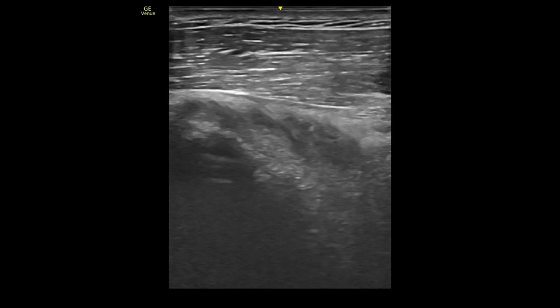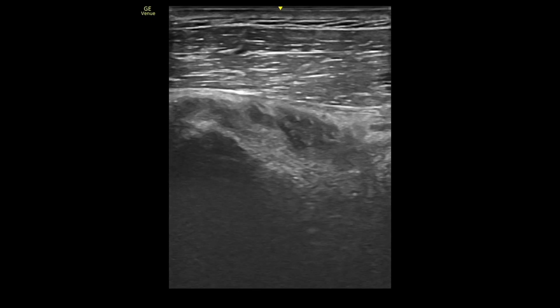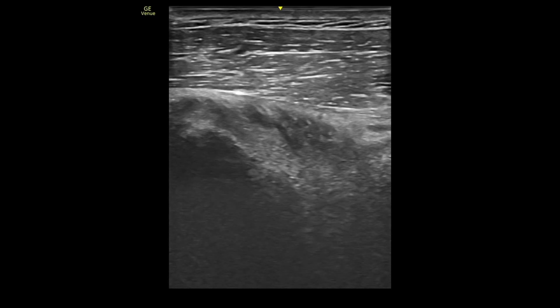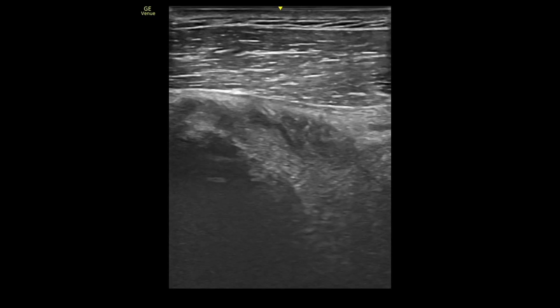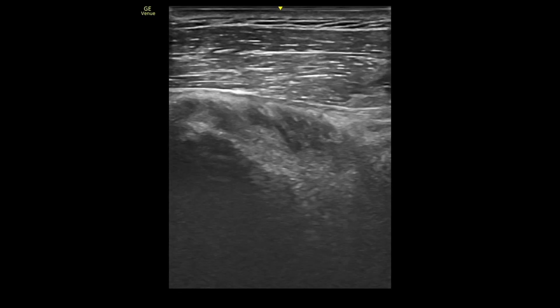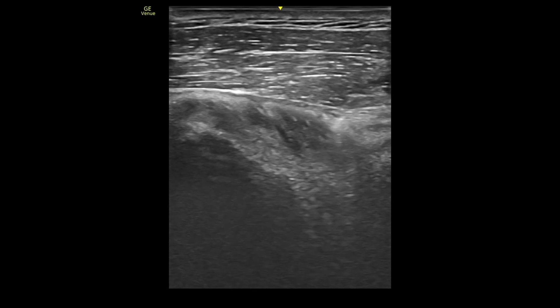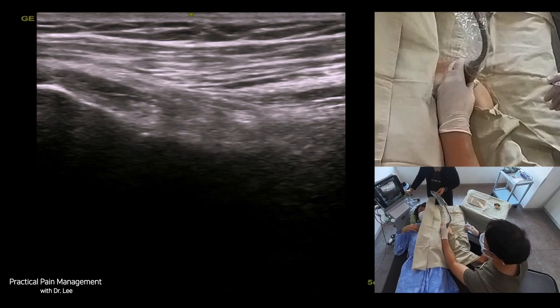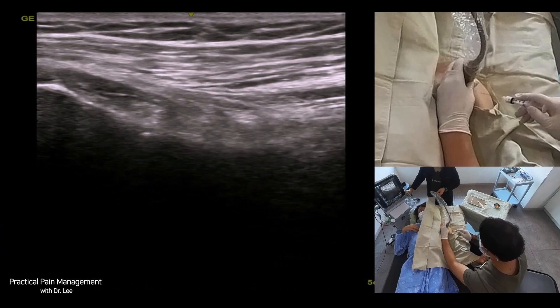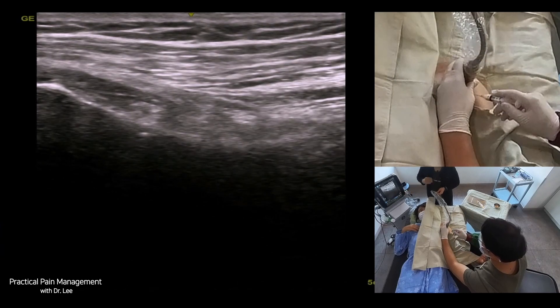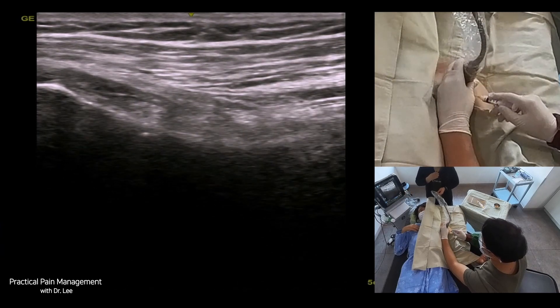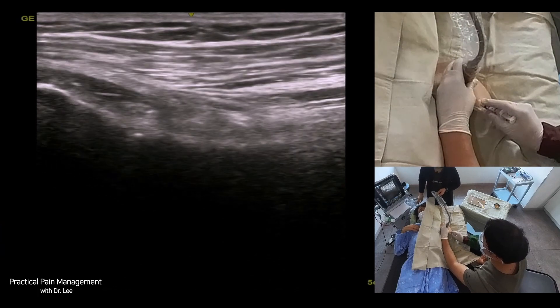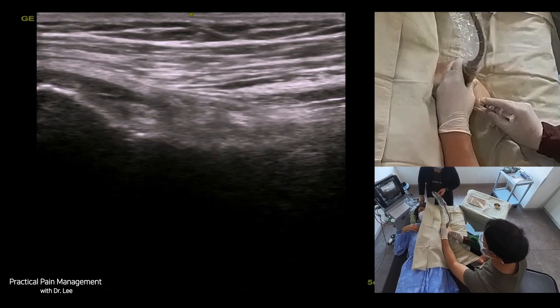Suppose you understand the bony landmark of the humerus, the inferior capsular attachment, and the inferior border of the whole structure — in that case, you will find approaching the inferior capsule much easier. Also, identifying the anterior or posterior humeral circumflex artery, which separates the subscapularis muscle from the teres major muscle, will help to target the inferior capsule.